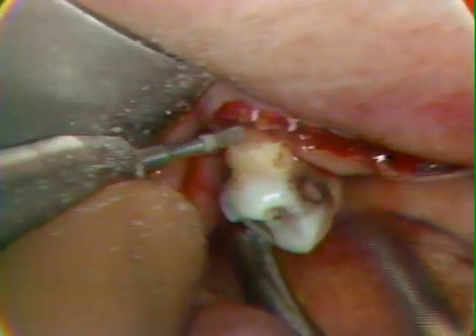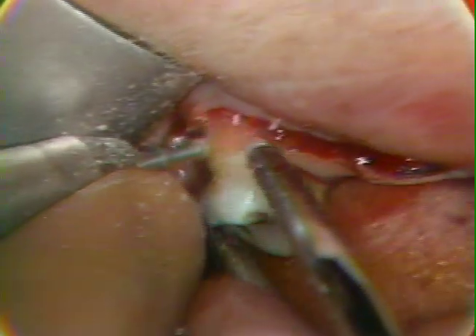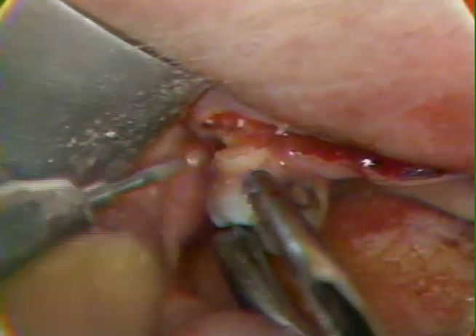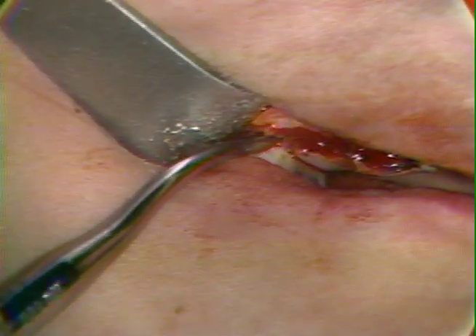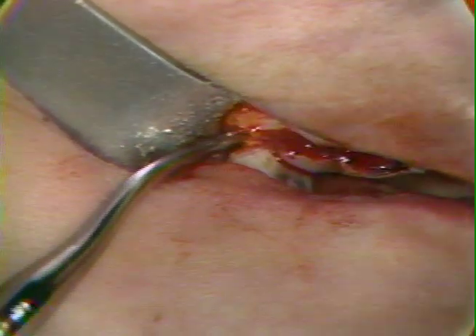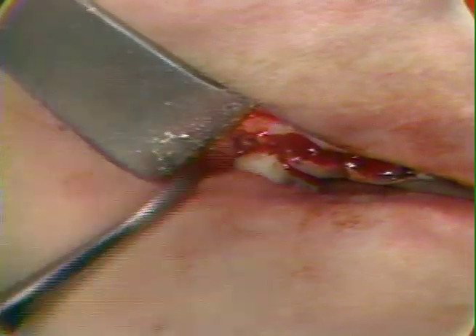Now I'll try to do the same thing on the distal. So we have the buccal roots divided. Next we'll see if we can take the crown of the, we have a 77R elevator here, and we can go in there and see if those buccal roots will crack off, and they did. At least the mesial one did. And that at least showed our approach.